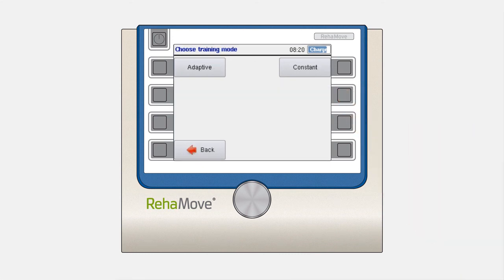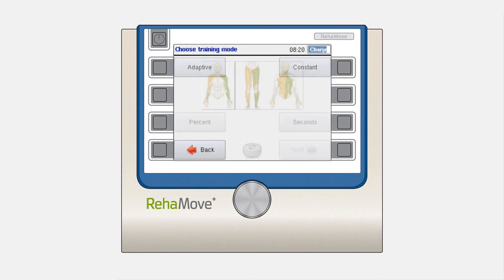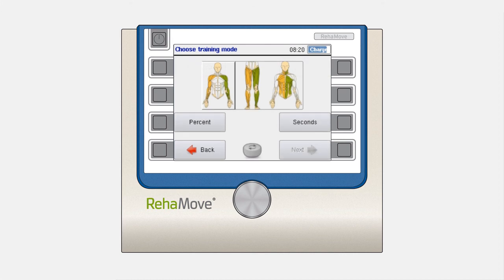For RehaMove applications, you have the possibility to choose between Adaptive and Constant Mode, and for Sequence Training, you can choose between Percent and Second Mode for Upper Limb, Lower Limb, and Torso or Abdominal Training.